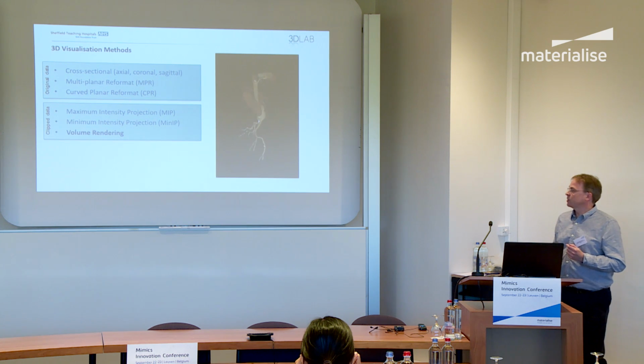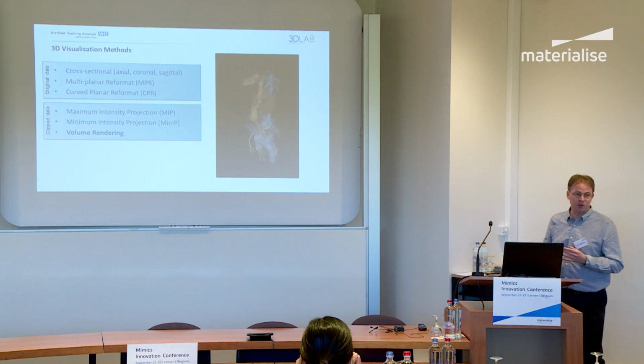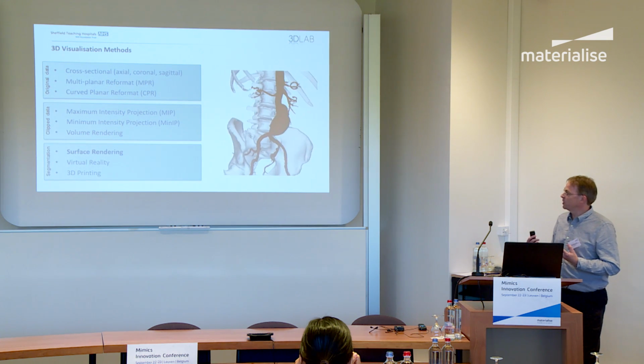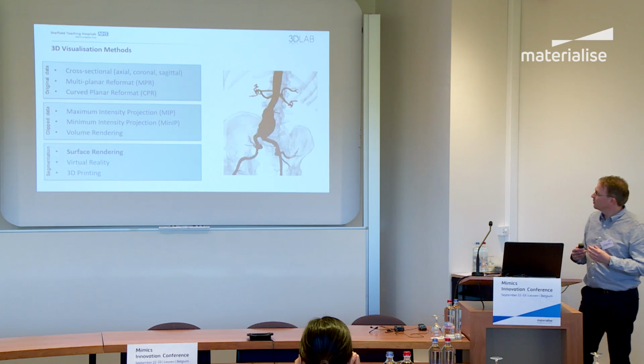So the only ways to address that are to either give the surgeons access to the volume rendering software, which can be quite expensive, and it's not always the easiest software to use, or can we manipulate the data and produce a surface rendering, such as this. Spinning around a bit fast.